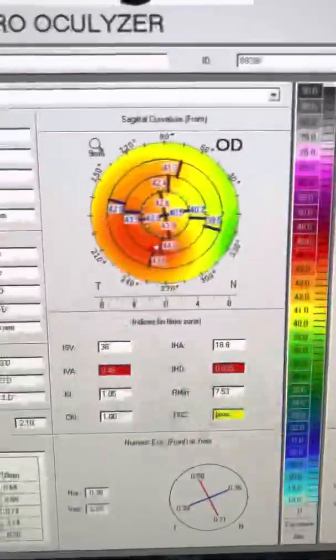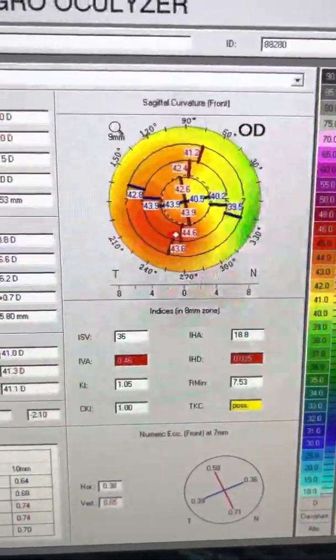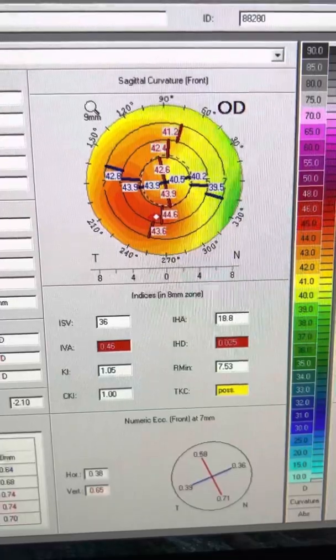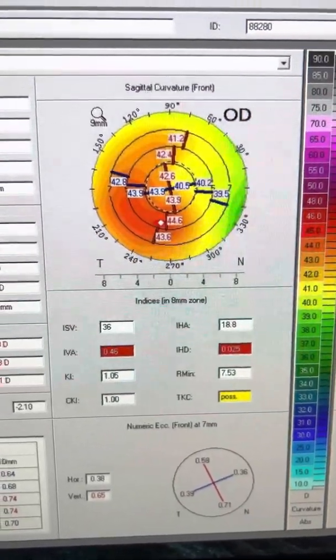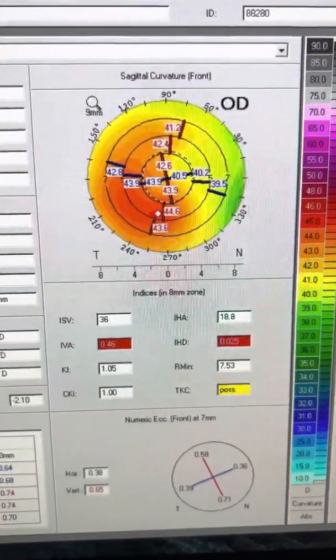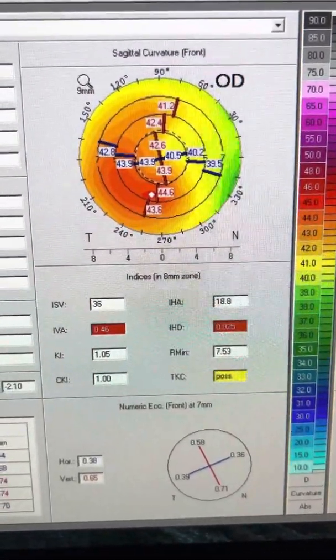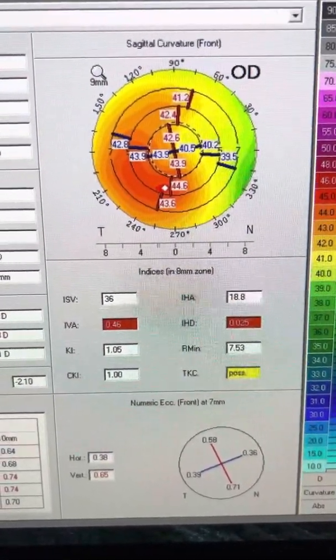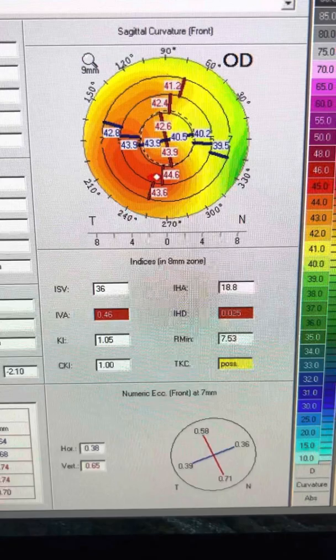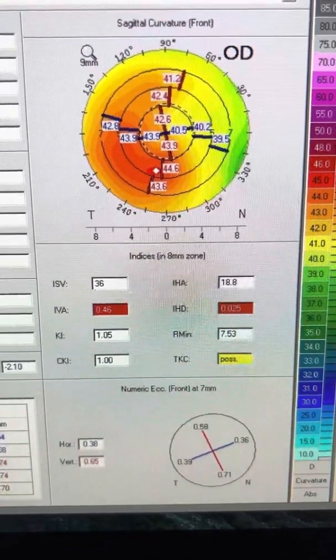And we're going directly to see a young gentleman here. These are his Pentacams from yesterday, May 4th, 2022.